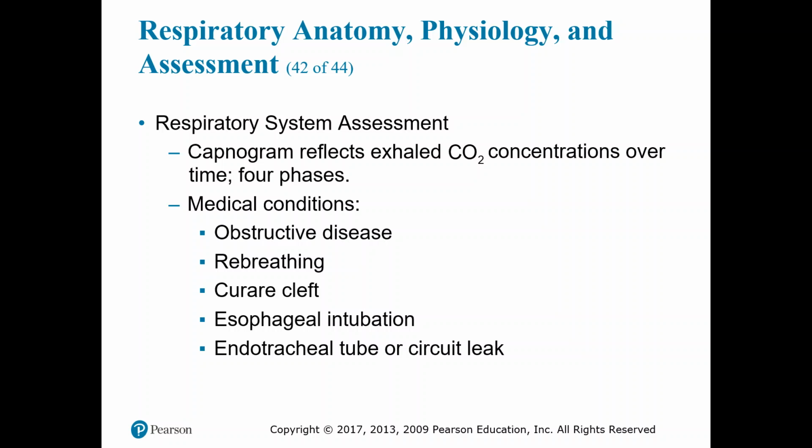So if you have a VQ mismatch or you're losing lung tissue due to a pulmonary embolism, atelectatic alveoli, or what have you, your end tidal is going to start to drop because you're losing that area for gas exchange. Either the blood's not getting to it, or the air is not getting to it, oxygen is not getting to the alveoli, and the CO2 is not able to cross the barrier because there's nothing there to exchange with.